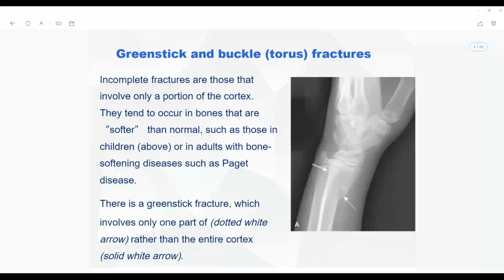The proximal end has the proximal epiphysis, the distal end has the distal epiphysis, which means I am taking an x-ray of the whole bone. Okay, right? And at the same time, include either the joint present proximally or the joint that is present distally.